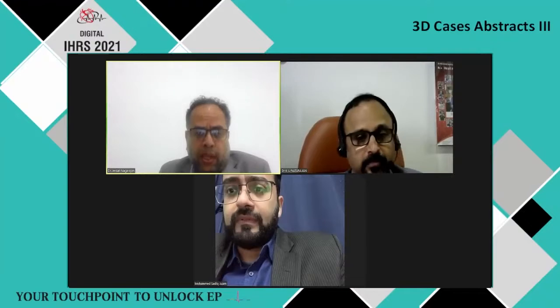And when you did the investigations, you did a cardiac MRI and very well showed the left ventricular non-compaction and also aneurysmal segments of the LV. What was the logic in doing an LV angiogram? Did you have any more information to gain?